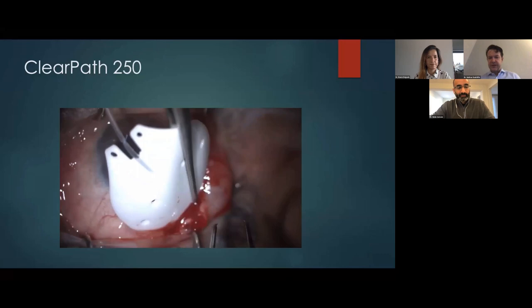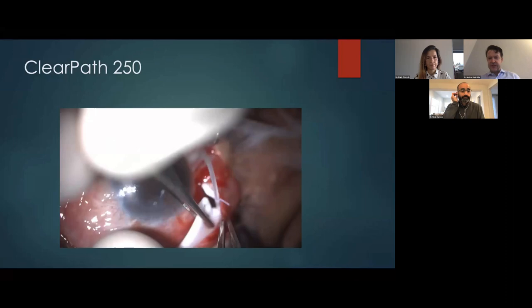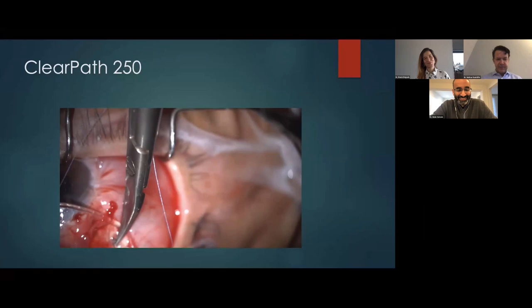So I'm pushing it in now, and there's a variety of ways to kind of taco the tube in, but it's fine to fold in half. It's going to be a tighter fit than the Ahmed valve, but we now have it back in that space. Oh, and I'm sewing. And it looks like I am about 8 millimeters back. So I probably failed my test of coming forward too easily.